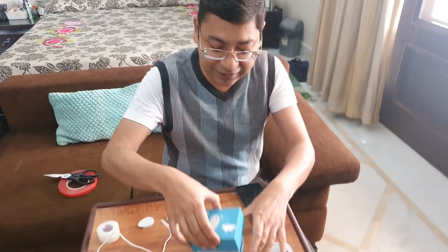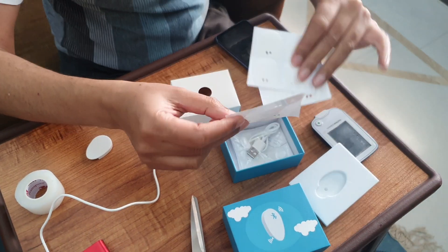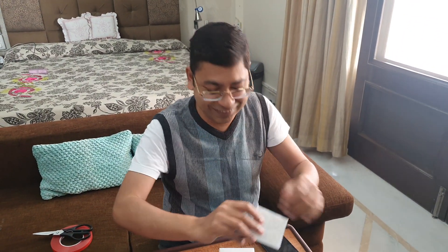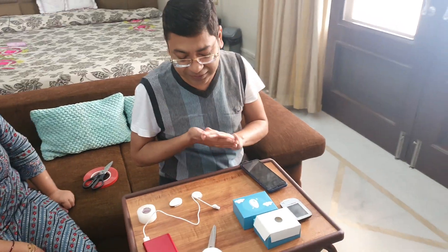Unfortunately, the stickers that come with this device are quite pathetic — they come off very easily and don't last even two or three days. We have been working on this and found the best technique.